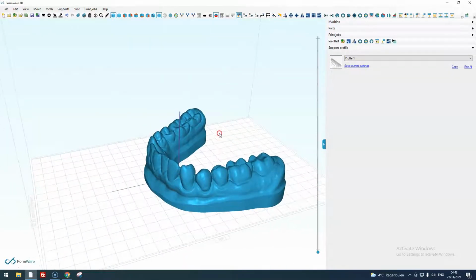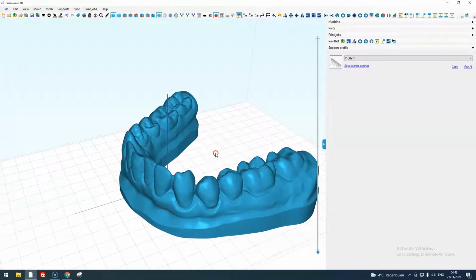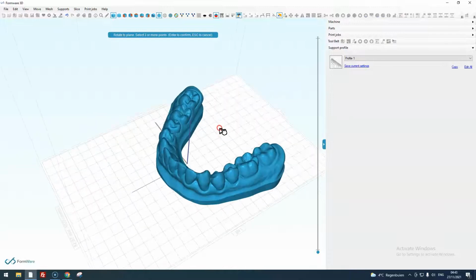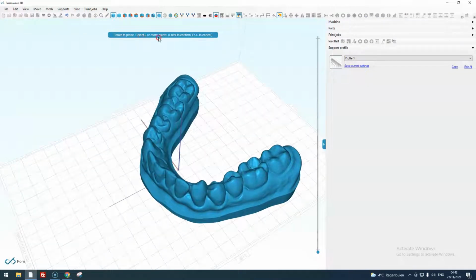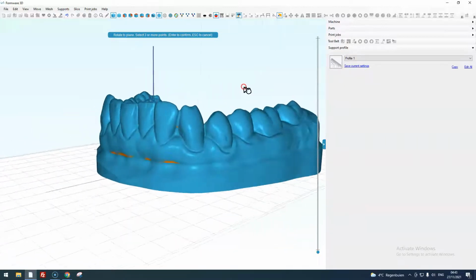Now, another scenario would be that you would like to print this upside down with all the teeth facing downward. But in this case, it would be hard to find one face that can be clicked to orient like this. So there's a second option, which is called orient to plane. This can be found here and as well in the move menu. And when you click this, it will ask you to select three or more points and then enter to confirm. So I will be doing that now.